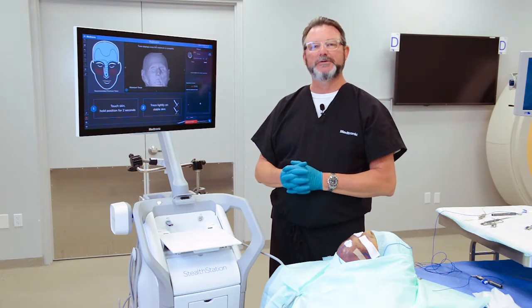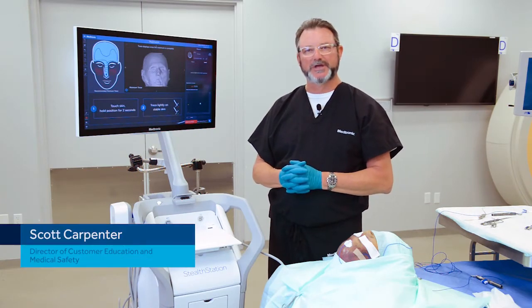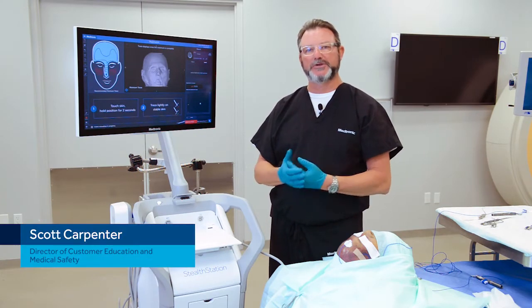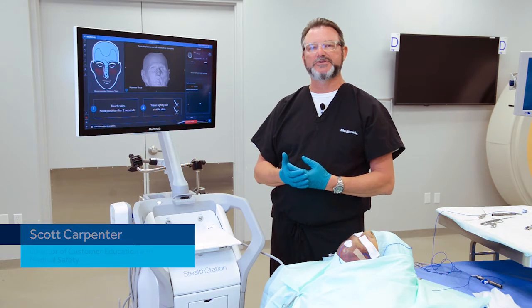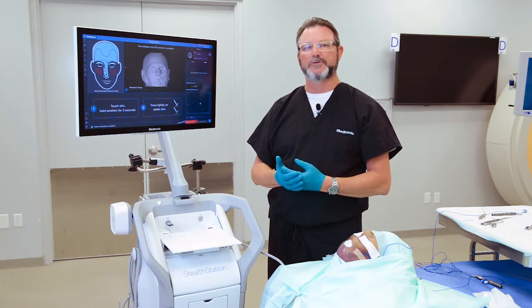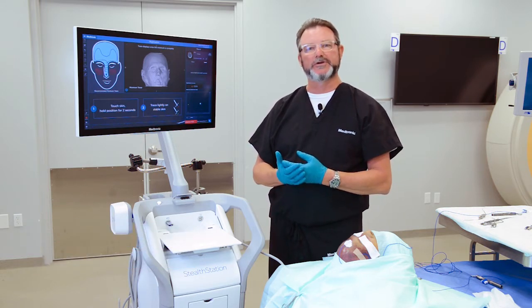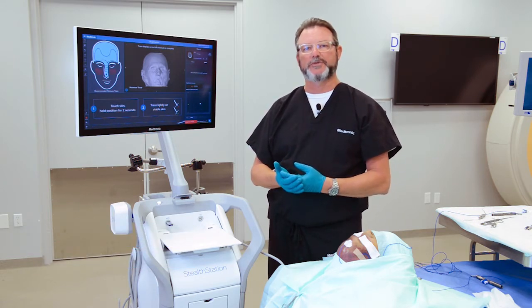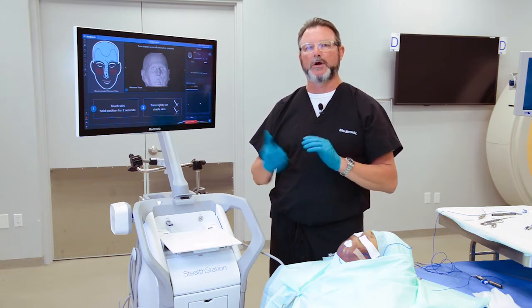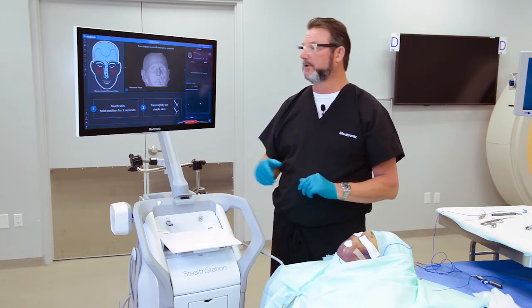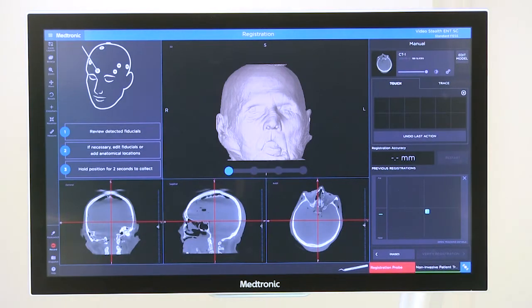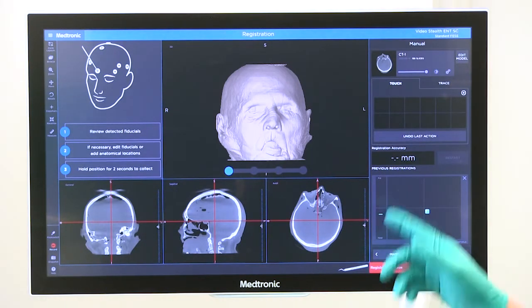Touch registration is a different type of both patient orientation and registration method. This allows you to select certain points on the CT scan that you're going to retouch with the registration probe in order to align our virtual world to the real world. To enable touch, just tap the touch tab.